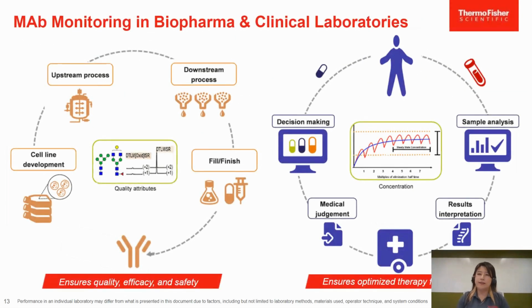So mAb monitoring is very important, both in biopharma and in clinical laboratories. I'm just going to show how biopharma monitors the mAbs, and also how clinical laboratories measure the mAbs during treatment. On the left side, through the entire manufacturing or development cycle, from cell line development, upstream process, downstream process, until formulation or fill finish, the quality attributes, for example glycosylation or oxidation, are monitored to make sure of the quality, efficacy, and safety of the drugs.